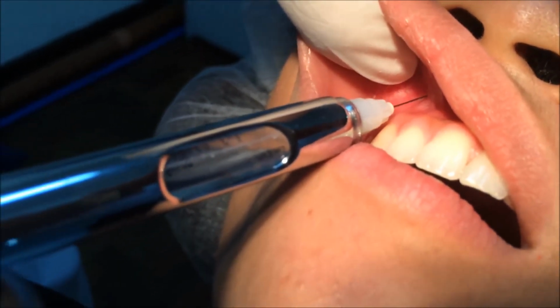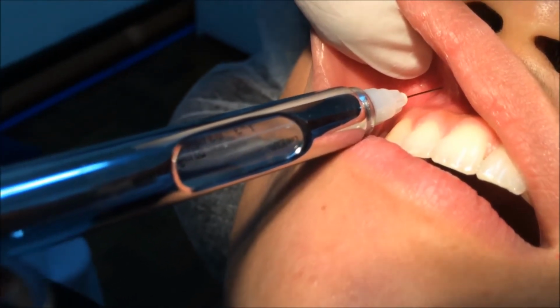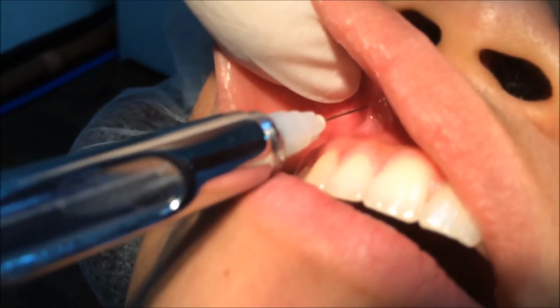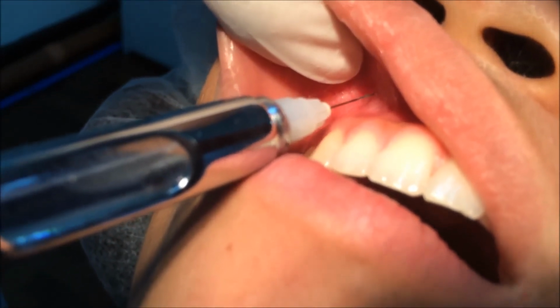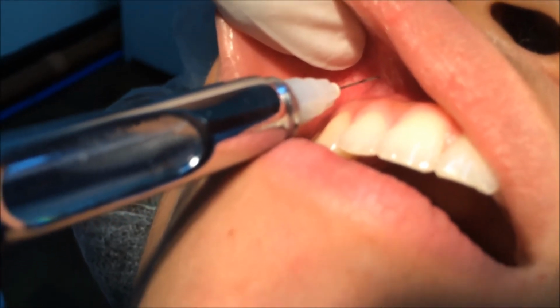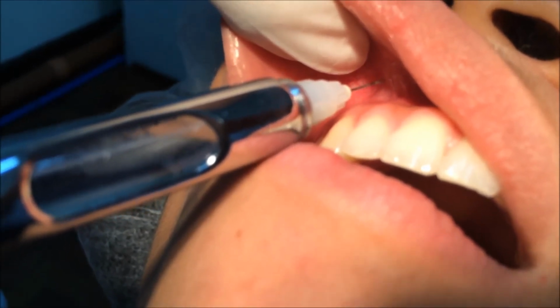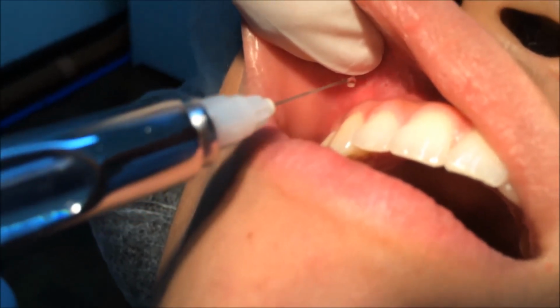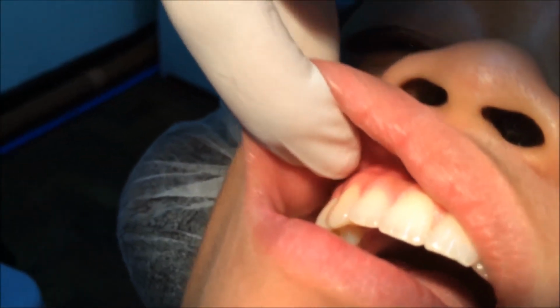Then we aspirate, and if it is negative, we deposit approximately 0.6 ml, or 1/3 of the cartridge, slowly over 20 seconds. We do it slowly so the tissue won't balloon. And then we slowly withdraw the syringe and make the needle safe using a scoop technique. And then we wait for 3 to 5 minutes before starting the procedure.